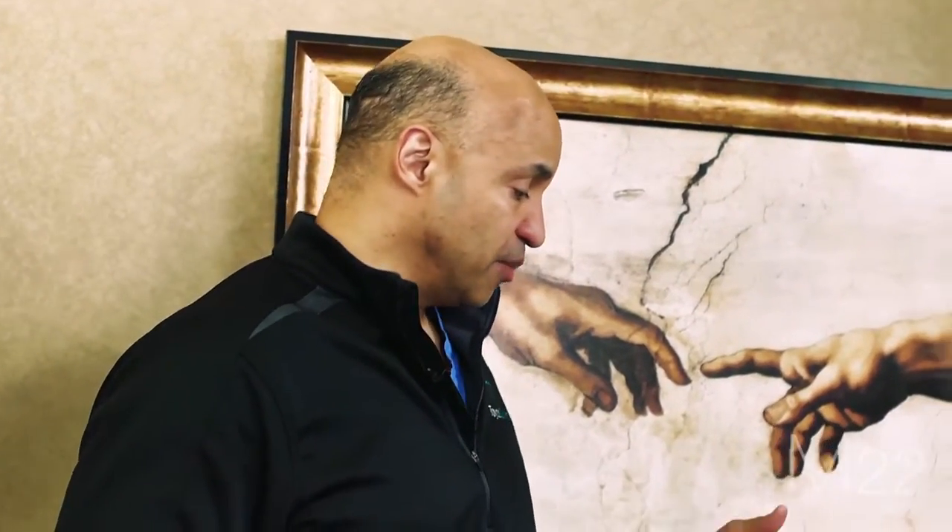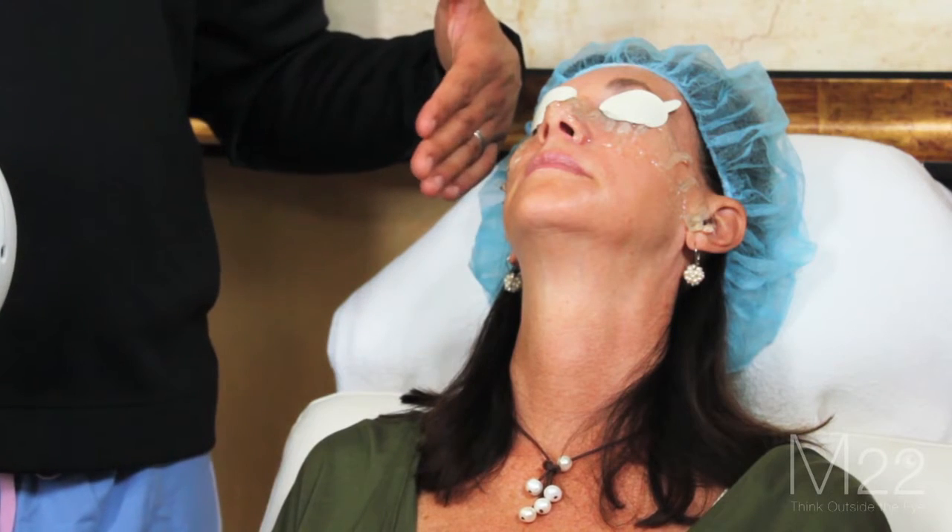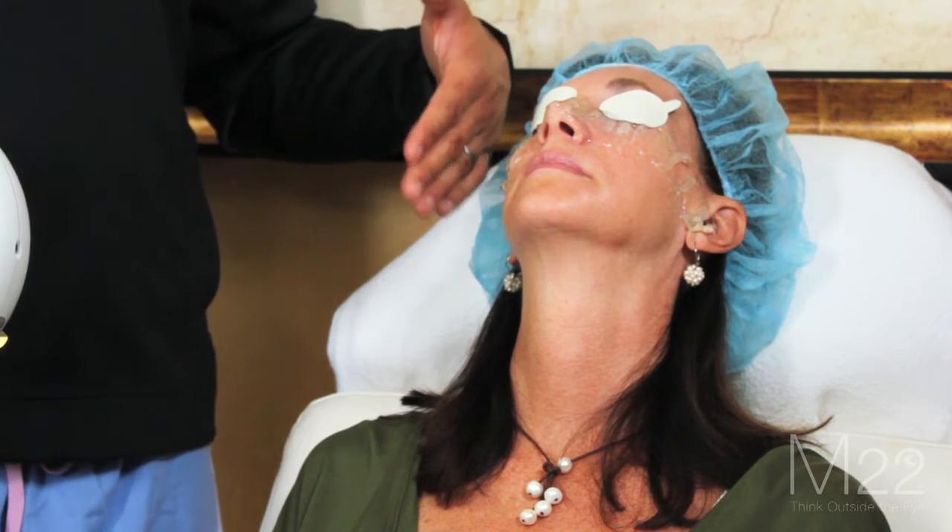One of the advantages patients will see with IPL is not only will it help their ocular surface, but it's going to help the skin where you're doing the treatment. So you're going to get some facial rejuvenation where you're doing the IPL. Some patients are going to ask if you can treat the rest of their face because they love the way their skin looks where you treated it.